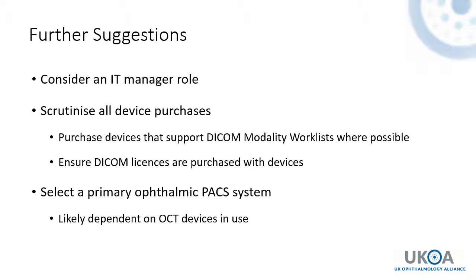Other aspects that can help improve this maturity and maintain it are consideration of an IT manager within the eye unit, having potentially that same person scrutinise all new device purchases. So it's not just about getting the historical data and the existing devices on the network.